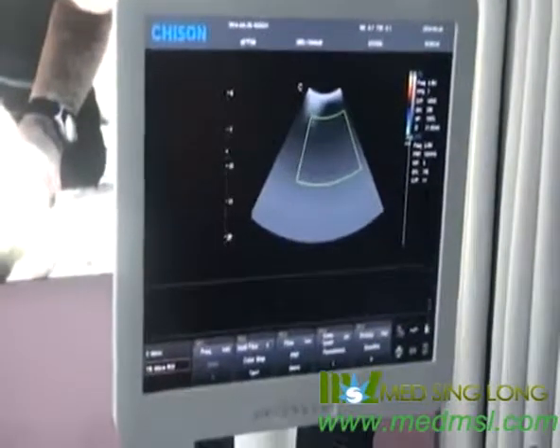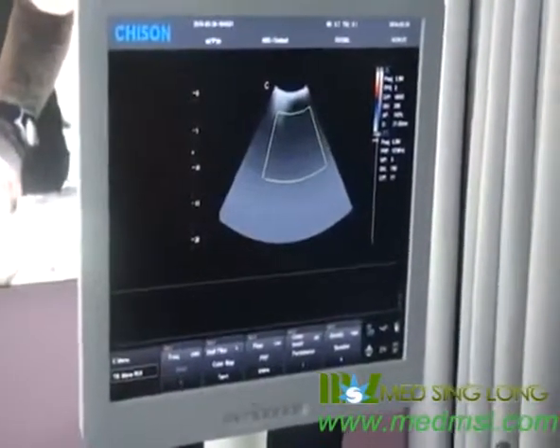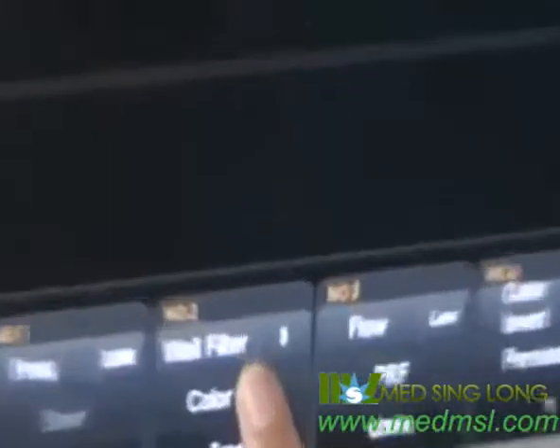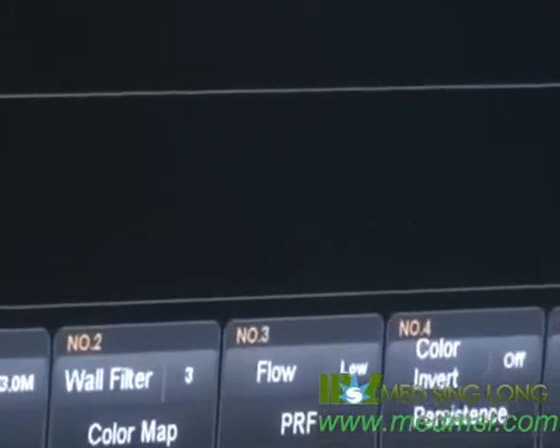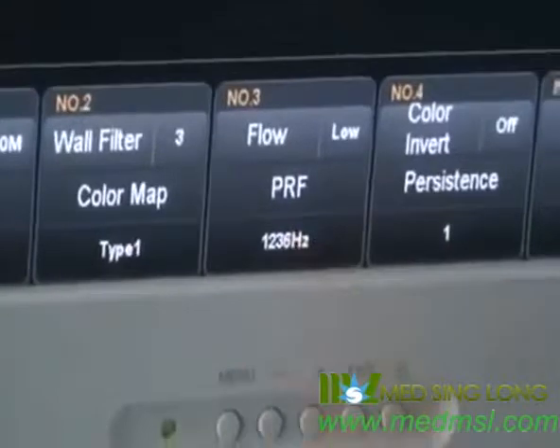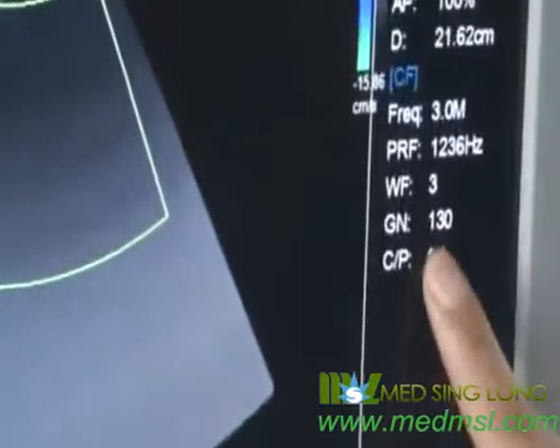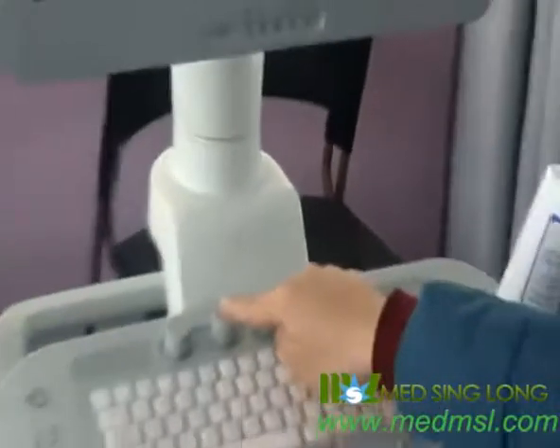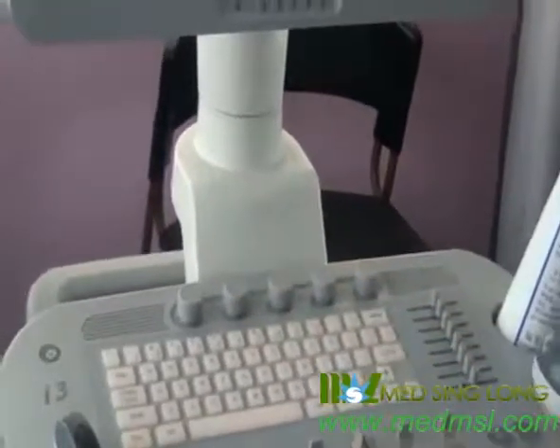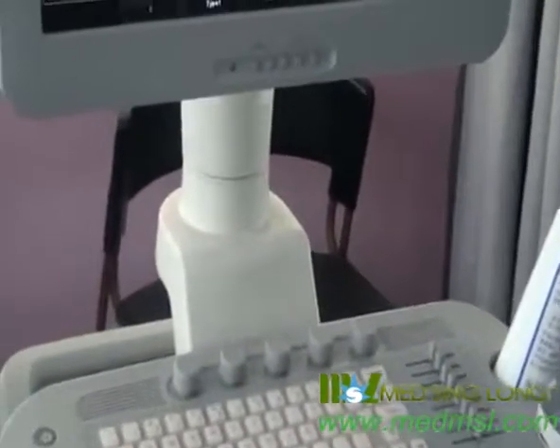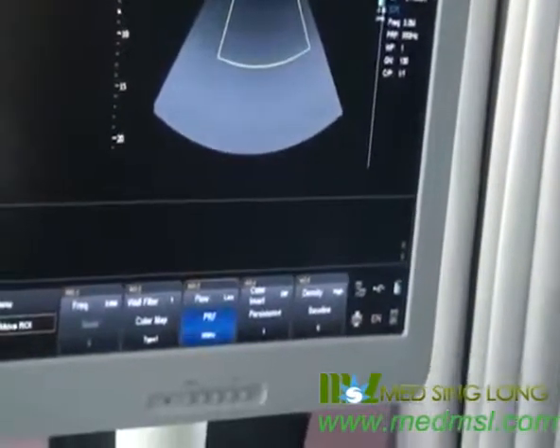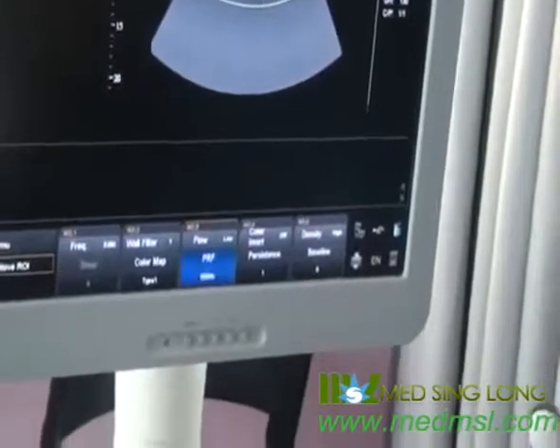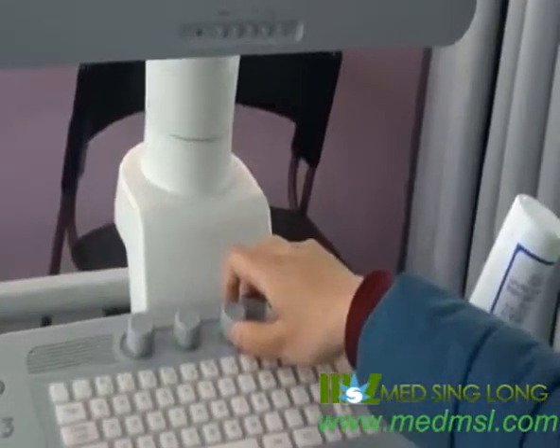In C mode, the most important parameters are wall filter, pulse repetition frequency, and color gain. Press the knob to adjust the wall filter. Wall filter is used to reduce the noise caused by wall motion. Rotate the knob to adjust the pulse repetition frequency.